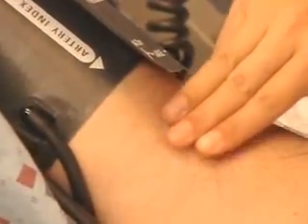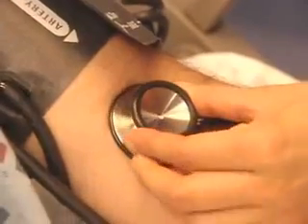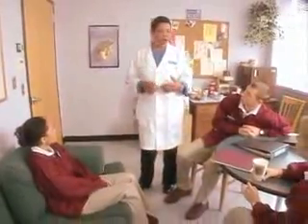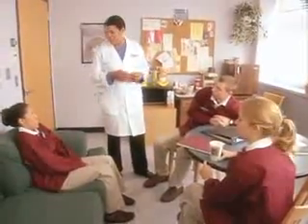Recheck the location of the brachial artery and make sure you have the head of the stethoscope directly over the pulse site. Now apply a little firmer pressure to the stethoscope just to be sure that there's a good seal between the stethoscope and the skin. If you're still having trouble, you might want to try another limb if that's possible. You should practice blood pressure measurement often in a quiet room to become more comfortable with it. I'll keep practicing. Good.